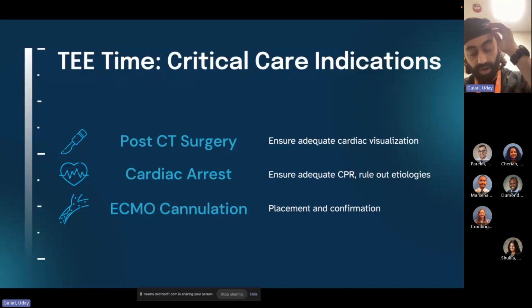It increases the proceduralist confidence that when they cannulate after the wire's in, it's going to go in, right? Because, for example, with ECPR, you're going to get these wires in, then you're going to administer heparin, and then you're going to start your serial dilations, and there's going to be a lot of bleeding. And then if you have a complication because your wire was not in the right place, it's very hard to come back from that, right? So you've already committed, you can't undo that commitment. And so having that confidence, I think, is just better for everyone.